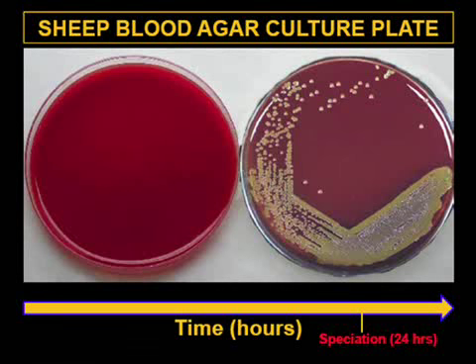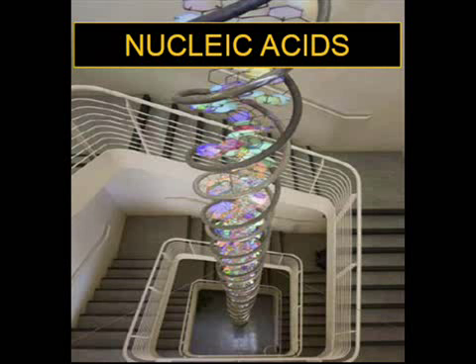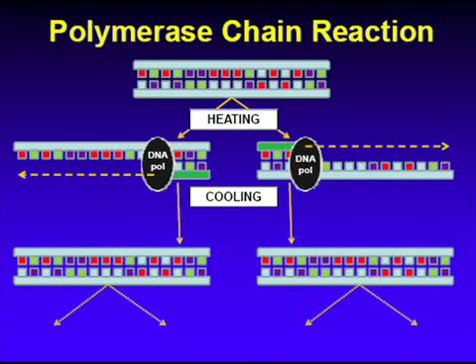This led to the development of new detection modalities such as nucleic acid tests, or NAT. Nucleic acid tests, such as those dependent on amplification methods, in this case polymerase chain reaction. Polymerase chain reaction, or PCR, was developed by Dr. Kary Mullis out in California, and essentially it relies on the standard concepts encompassing DNA replication, where first you must denature the DNA.